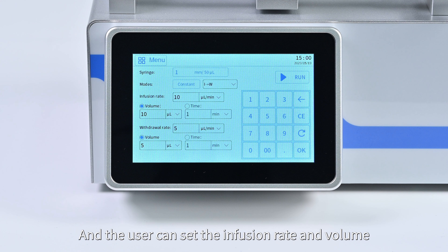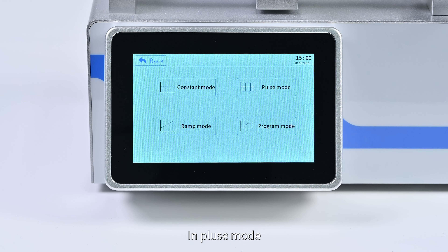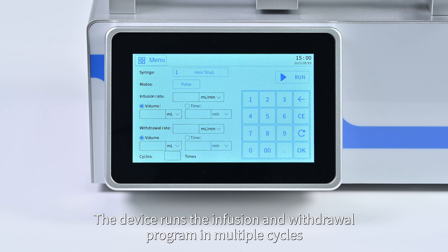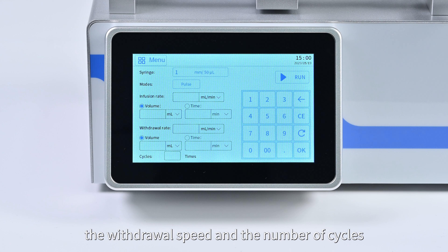In constant mode, the user sets the infusion rate and volume, as well as the withdrawal rate and volume. In pulse mode, the device runs the infusion and withdrawal program in multiple cycles, and the user sets the infusion speed, withdrawal speed, and number of cycles.